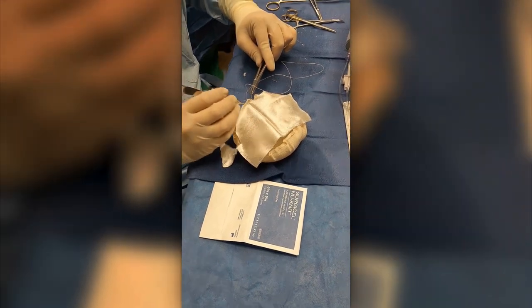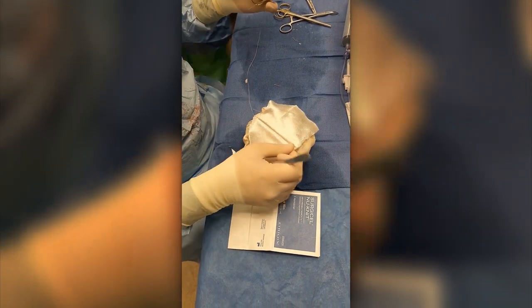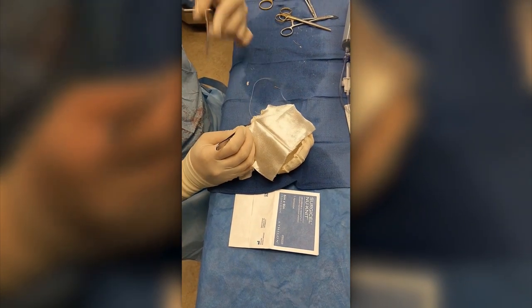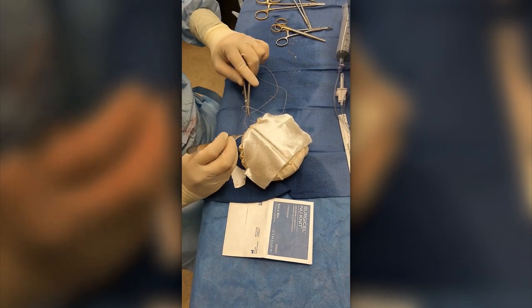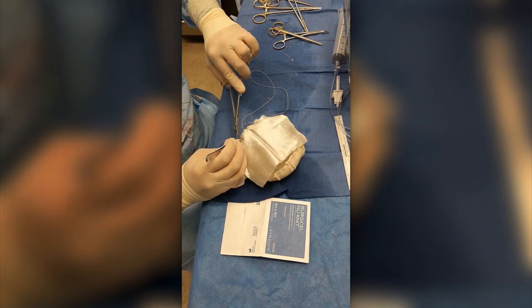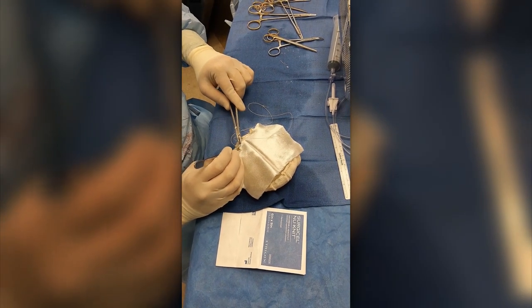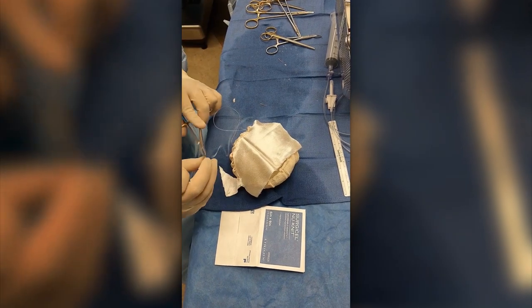Putting this into place now and I'll tailor it as I go, so I'm just going to start sewing one side. I like to keep this dry — the product does get wet, it is a little bit soft — so I like to keep it dry until it goes into the mastectomy pocket. It's a hemostatic product, so it goes against the pectoralis muscle where it not only helps keep this intact while it's setting, but it also helps keep the muscle dry and works as a hemostatic agent.